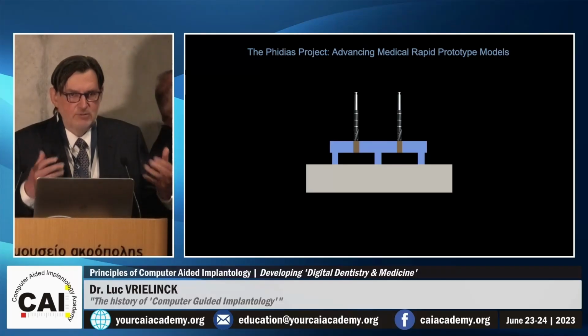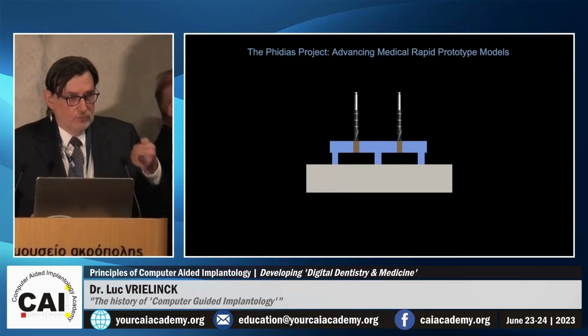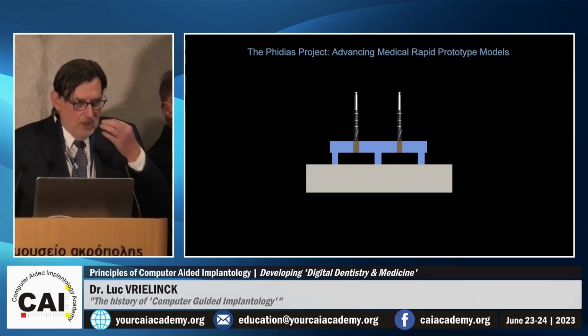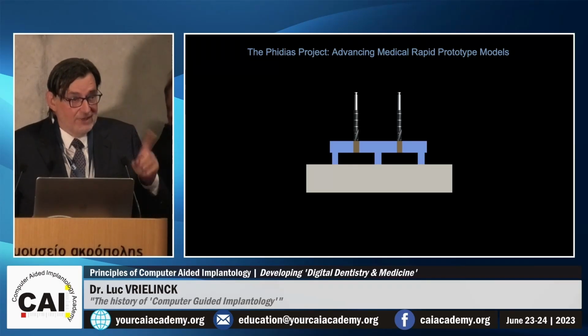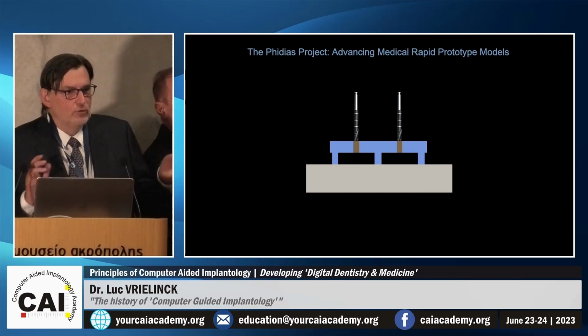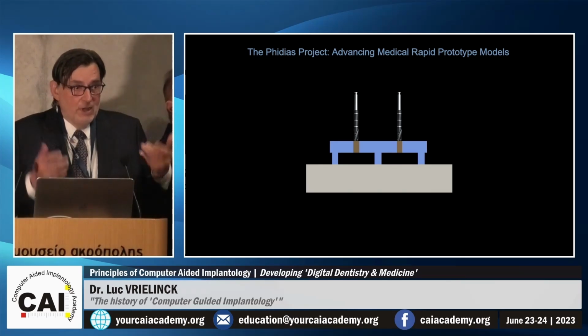So this is the abstract concept. And then you have Materialise, which is a professional company, and they say, okay, we want to do that, but we have to validate it. Each step has to be validated. If we ask a drill guide from our dental laboratory, it's not validated, of course, but here it's commercial, so the requirements are very high.